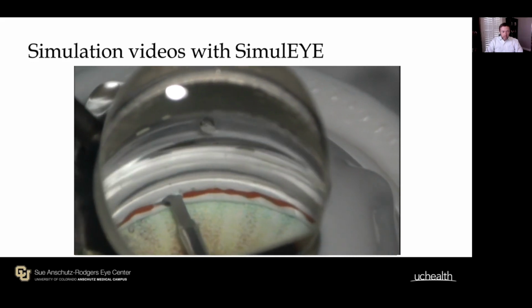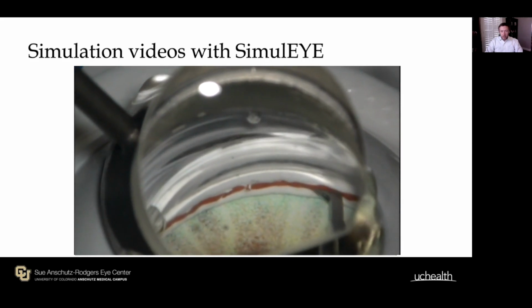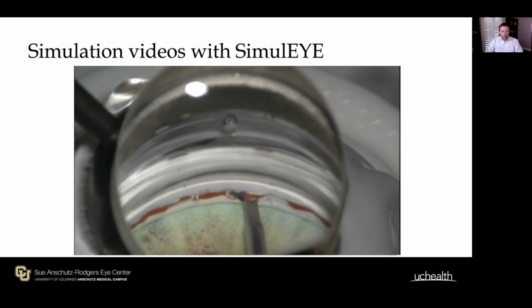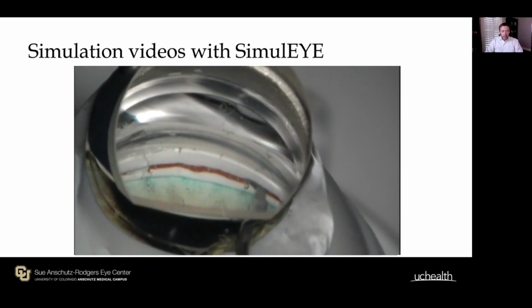And in this first technique, this is the mark and meet. So we're making an initial incision to the left and then proceeding from the far right and bringing it back to the initial incision. And you can see I'm a little bit shallow. You can see a lot of the ramp of the device. I'm really just skating on the top of the TM.